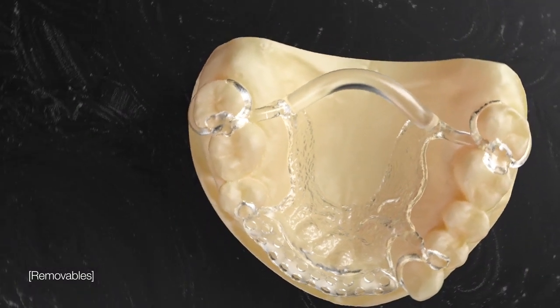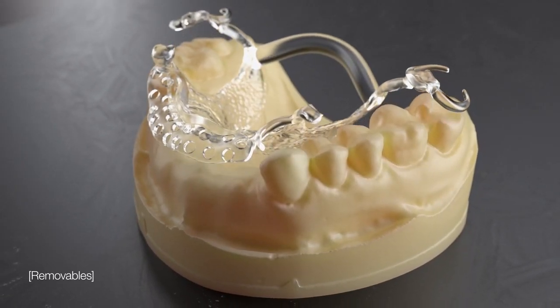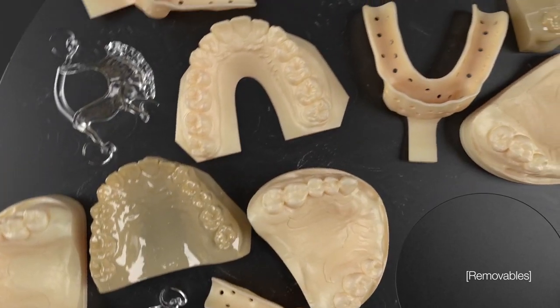Outperform traditional dentistry and automate the process of cast chrome partials. Reduce patient visits and resets, thanks to highly precise printed frameworks that can be printed with models simultaneously.